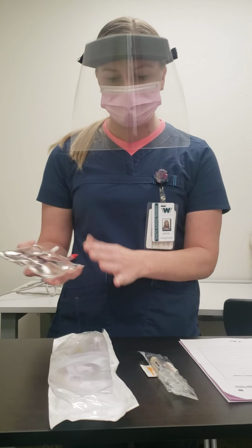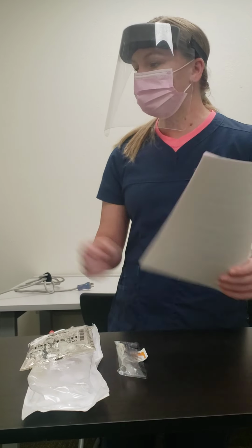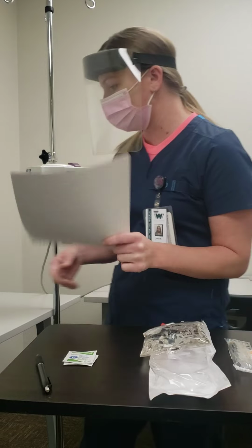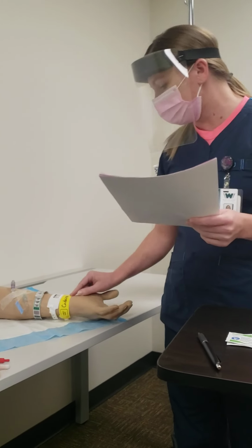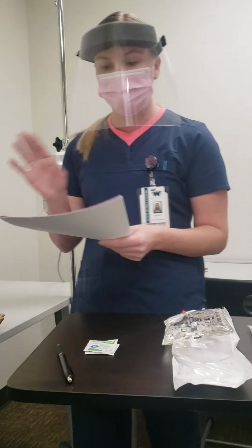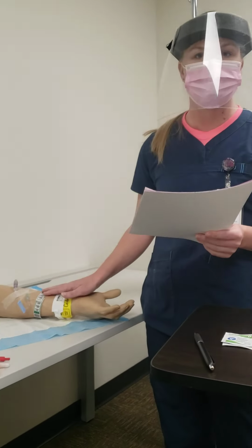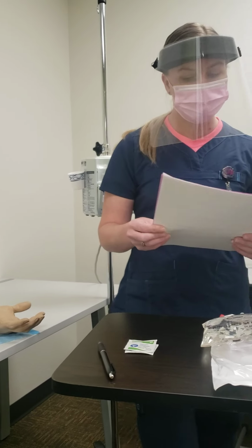So I have my normal saline, my blood tubing, and a flush. Okay, so knock, knock, knock. I enter the patient's room. Hi, Samantha. I'm just going to verify your name and date of birth. I have Samantha Lewis, 6/10/1975, and she has an allergy to codeine that matches my healthcare provider orders, and I'm just noting that she has on a blood band for her cross match.